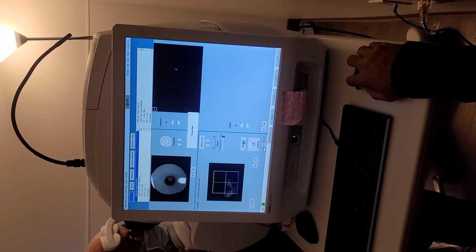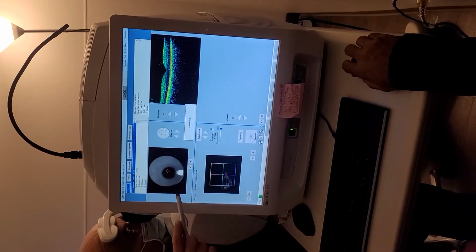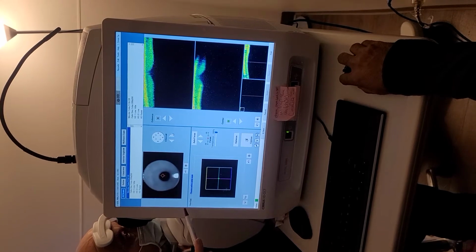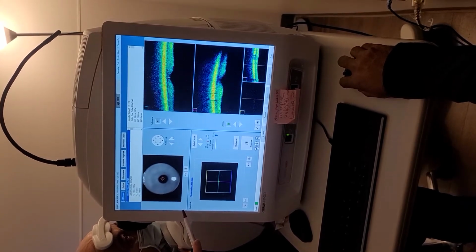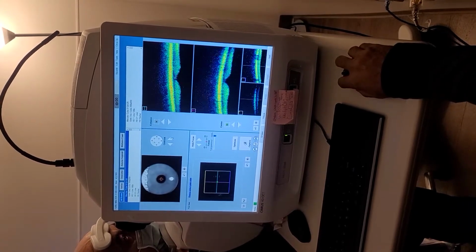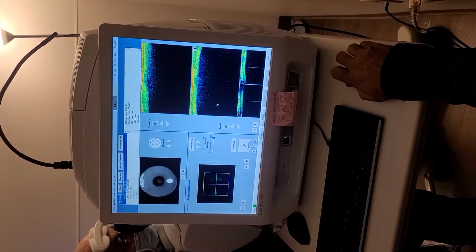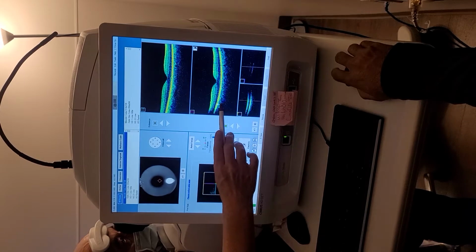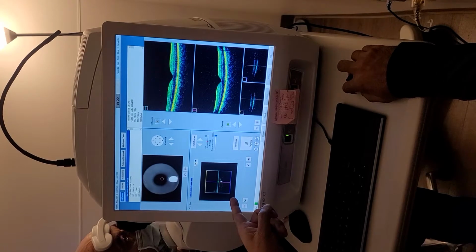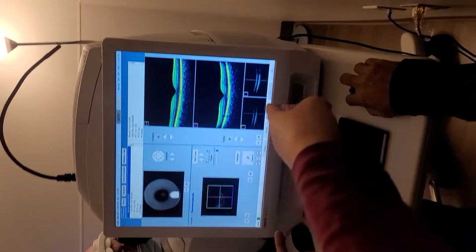Optimize. And try to bring him in a little bit over here. More. Yes. More, more, more, a little bit more. A little bit more. Okay, now invert it. Go to up, invert it. Up, up, up, yep. Get that in the center. Yes, okay, center. Good. Now it is center. Okay, now what you want to do is optimize it. Optimize it.